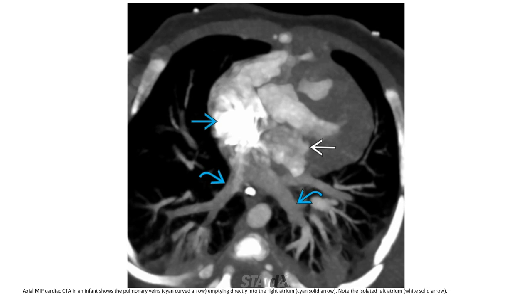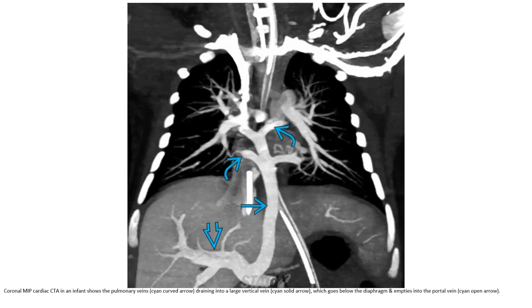This is the CTA of a patient with cardiac Type 2 TAPVR, showing pulmonary veins emptying directly into the right atrium, not the left atrium. Another CTA demonstrates the pulmonary vein draining into a large vertical vein, which goes below the diaphragm and empties into the portal vein.